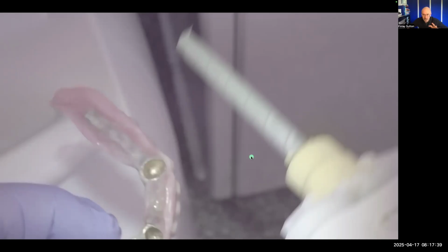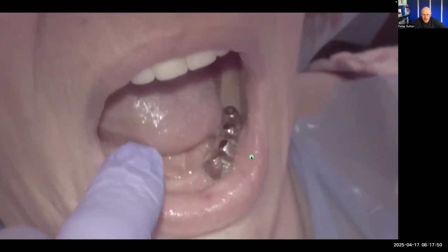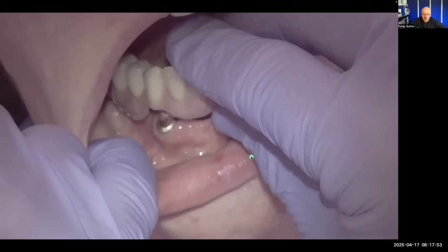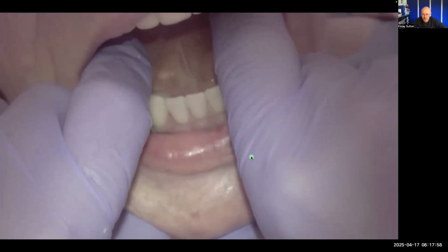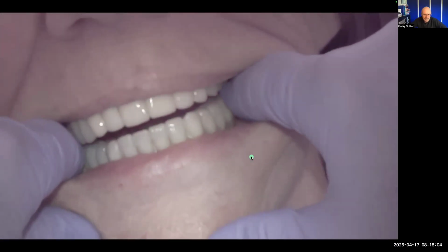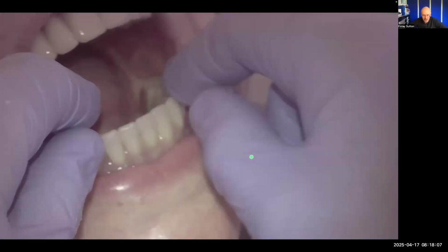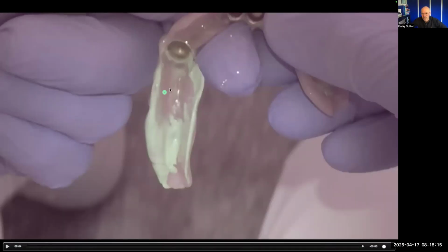So this is what I did. I put some silicone on here and took it to the mouth. This is a fit check. I love it. Light-bodied silicone. Pop it on, push it down, press it firmly down. Get Jackie to bite together firmly, and then take that out when it sets. And you can see that this is where it's hurting. It's pushing through on that area, and she said that that was sore.